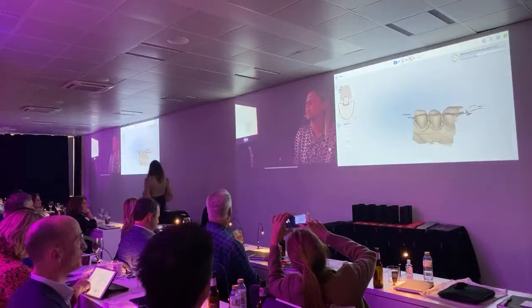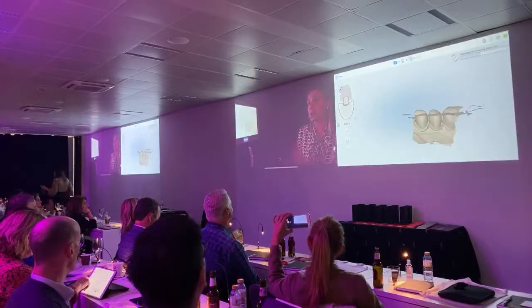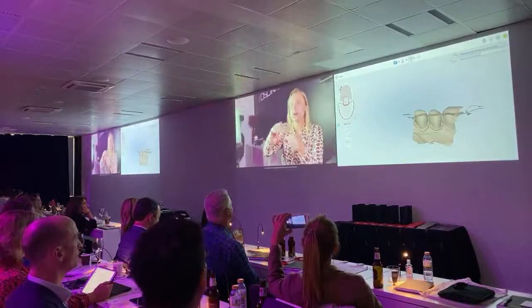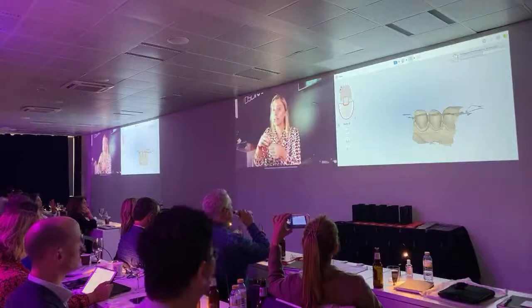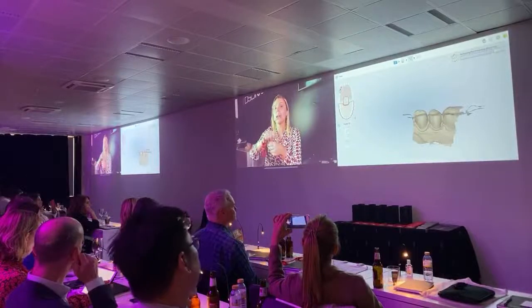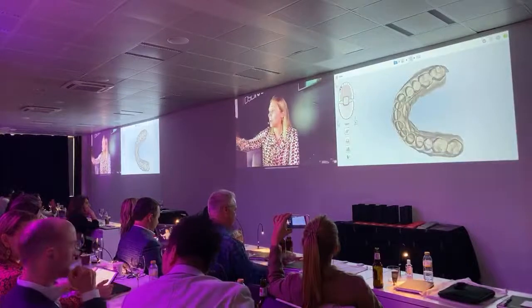The image is gonna post-process, and then you're gonna limit the area of the high definition. Remember when I said place the middle of the green cross very in the middle of the occlusal area or the incisor? Because this will guide the camera to capture in high definition only that area of the prep. That will make your life easier now.